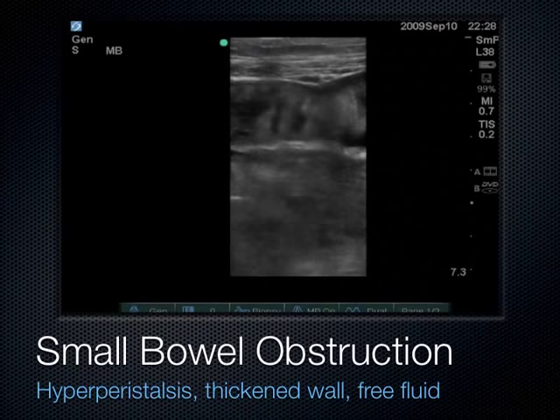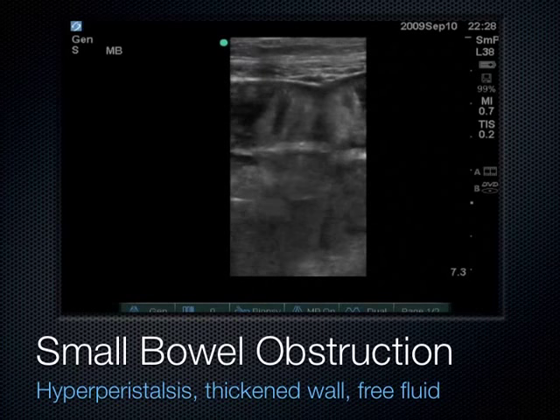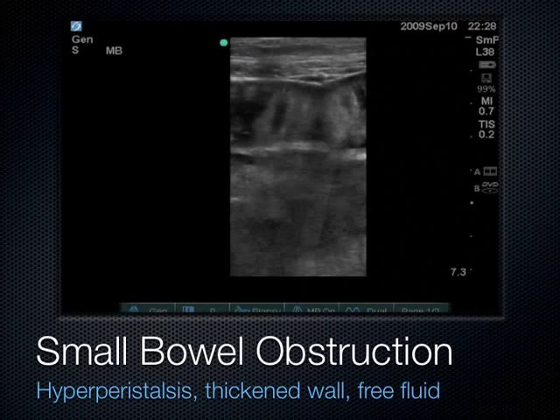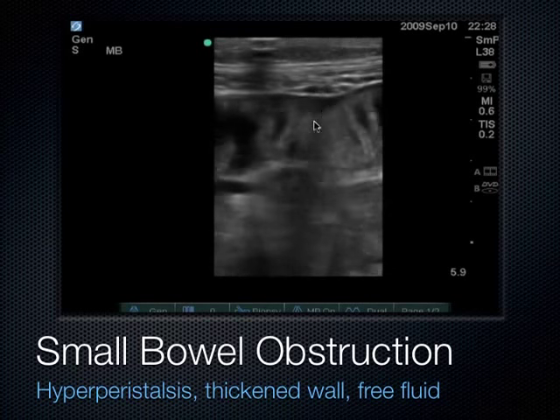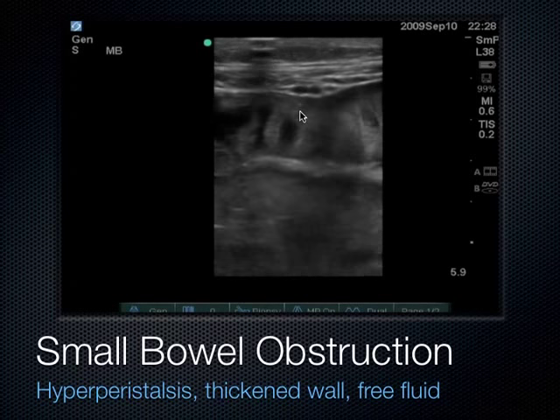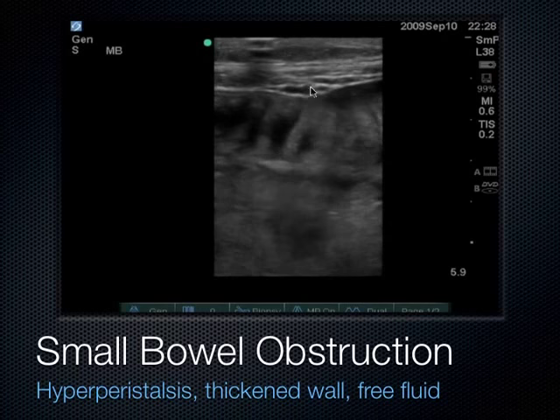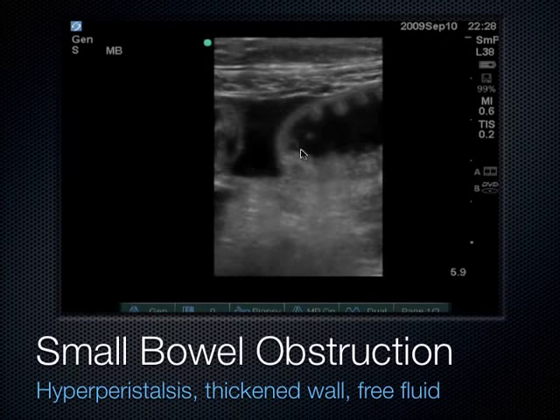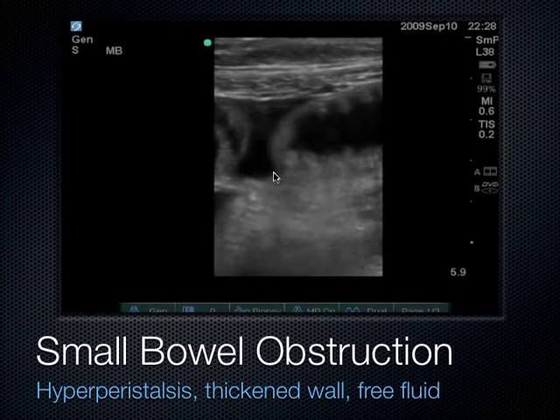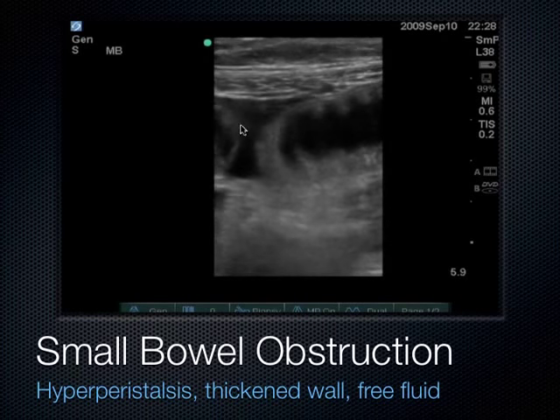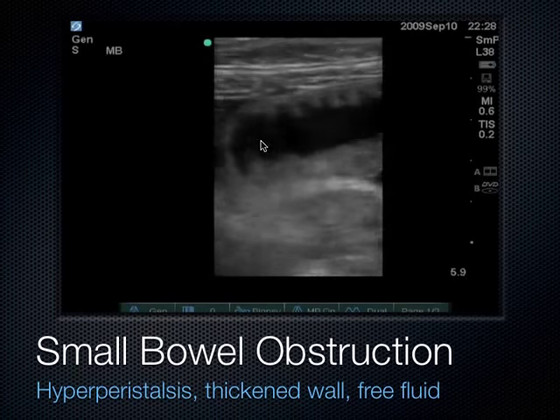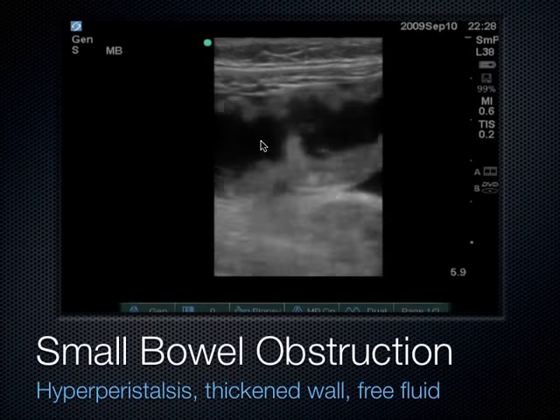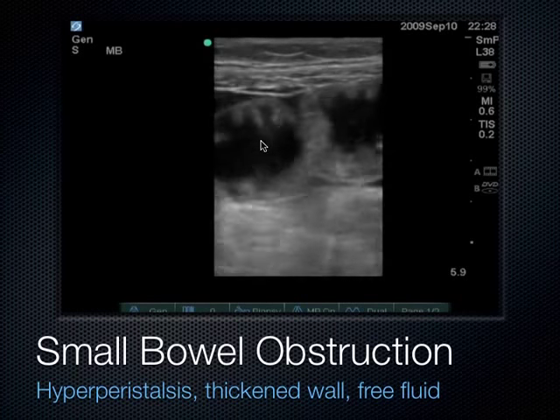Here's another example of small bowel obstruction. We can see the plicae circulares going across this pretty dilated loop of small bowel, and there's also fluid between these two different loops next to one another — fluid surrounding it, which tells us there's probably been perforation.